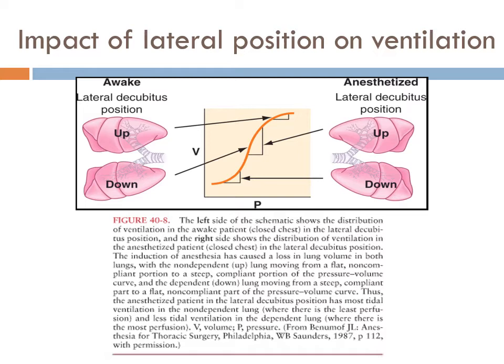So ventilation becomes an issue with a lot of these patients because, again, we're trying to ventilate lungs that are in different stages of compliance. So these graphs talk about the compliance. This is a compliance curve. The most compliant you'll ever be is probably right here, where very little is needed, and this is how you read this curve. I do put pictures of curves in the test to see if you understand what you're reading, because then you understand the greater concepts.